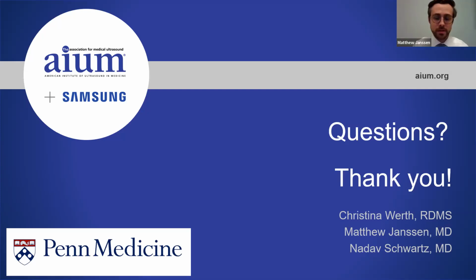And then we have a question here that says, do you routinely take clips of all the heart views, or does a still image suffice? And I think this would be a great question for Christina as well. Yeah, I can take this one.